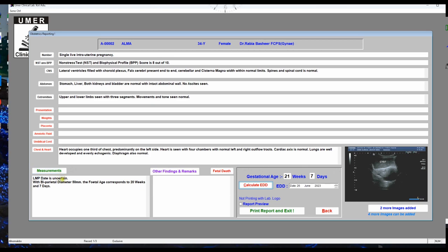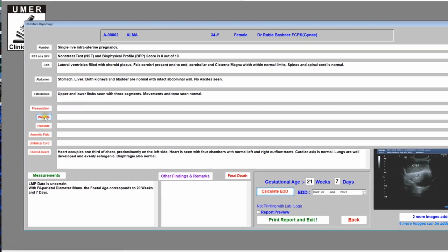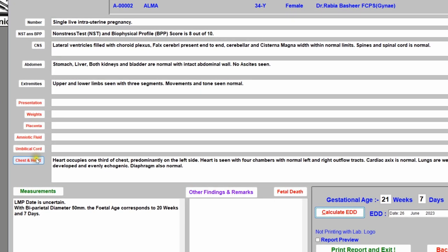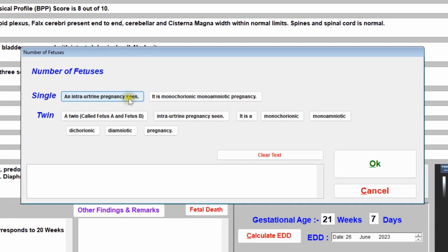After you enter the biometry measurements, the options for presentation, fetal weight, placenta, amniotic fluid, umbilical cord, chest, and heart will become available. If you don't enter the measurements first, these options will not be available to you.